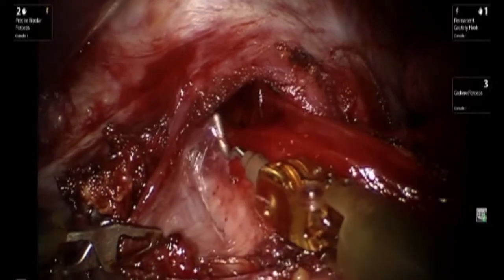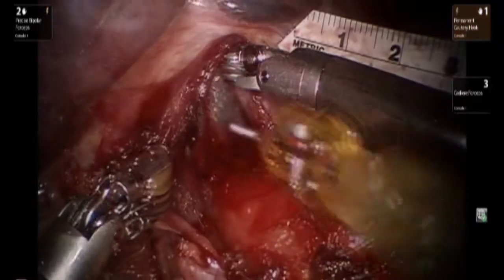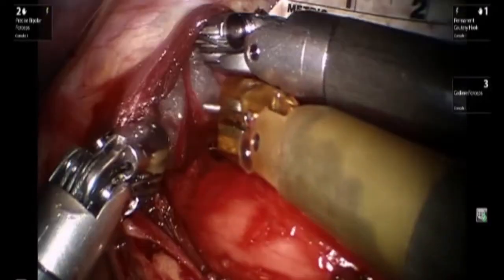Please note that dissection is taking place to expose the anterior surface of the esophagus, as it's not customarily required to perform a complete circumferential dissection of the esophagus when performing the Heller myotomy.